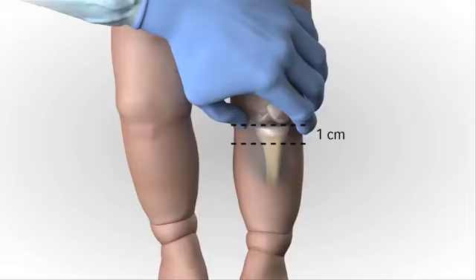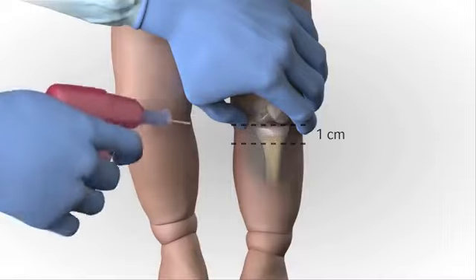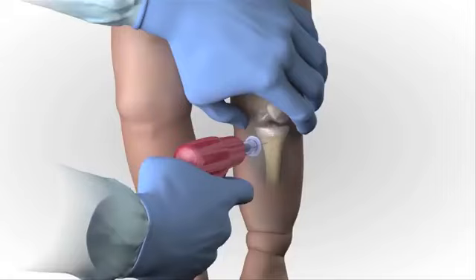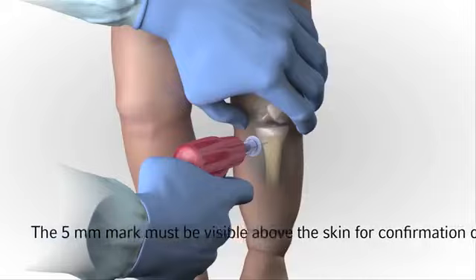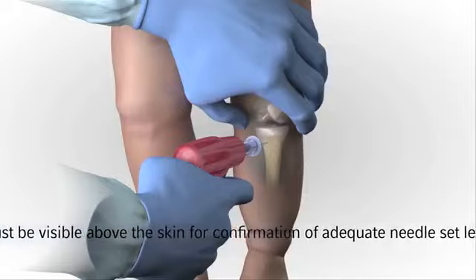Remove the needle set cap. Stabilize the extremity. Aim the needle set at a 90-degree angle to center of the bone. Push the needle set tip through the skin until the tip rests against the bone. The 5 mm mark must be visible above the skin for confirmation of adequate needle set length prior to drilling.